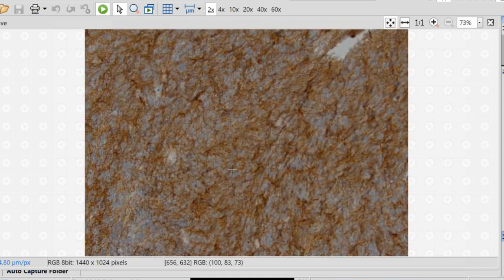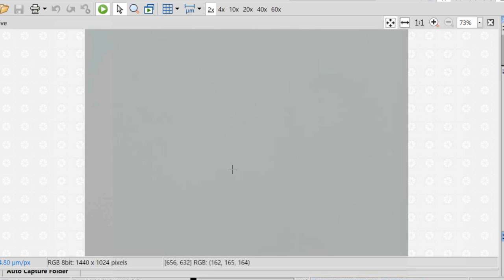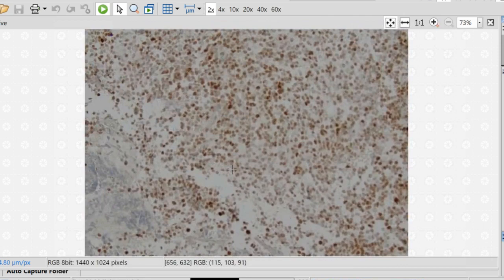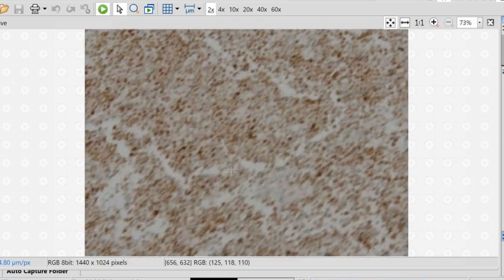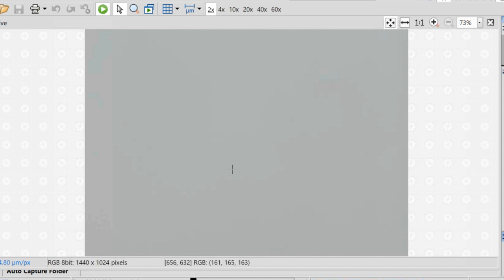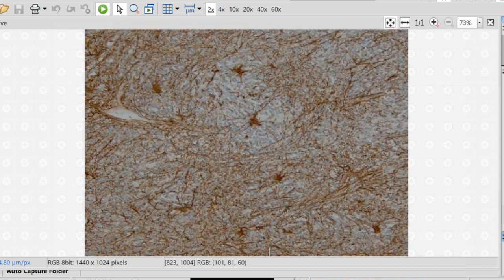GFAP is mostly negative, but you can sometimes have focal positivity. Once you feel comfortable you're in the medulloblastoma camp, another useful immunostain is INSM1 for neuronal differentiation in the CNS. You may be more familiar with this marker in the setting of neuroendocrine tumors, but it is also a good marker for neuronal differentiation in a variety of CNS tumors. It can be used as another confirmation marker. The GFAP in this case showed large reactive astrocytes with a lot of processes in between.